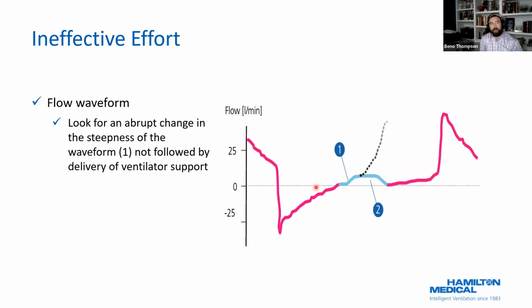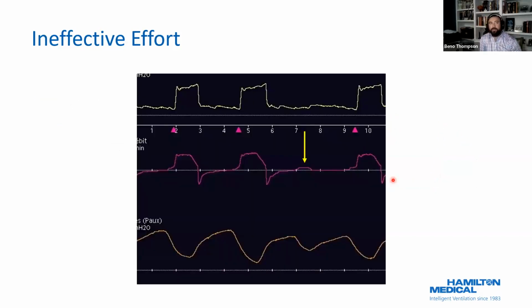And we're going to blow this up and just show you an increase in flow, but no ventilator-delivered support during the expiratory phase. This is most definitely a missed trigger, right? That little bump in flow is going to tell you right there.